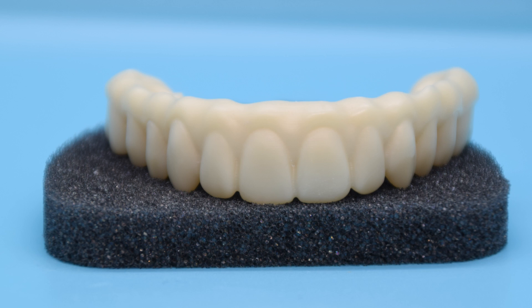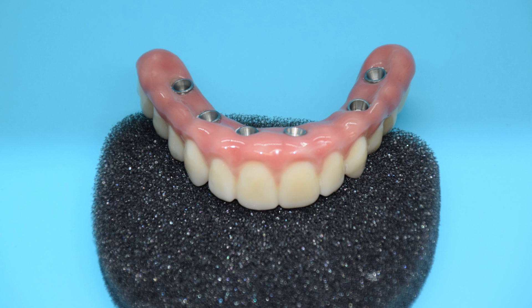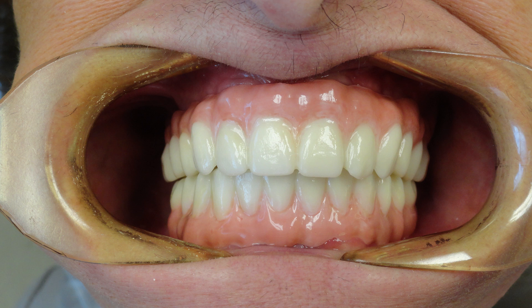Your final all-on-four zirconia arch will require daily maintenance. It is important to work floss around the implants and under your prosthesis to ensure that plaque does not build up there. It is also important to continue to see your dentist regularly so he can inspect and clean your implant prosthesis.